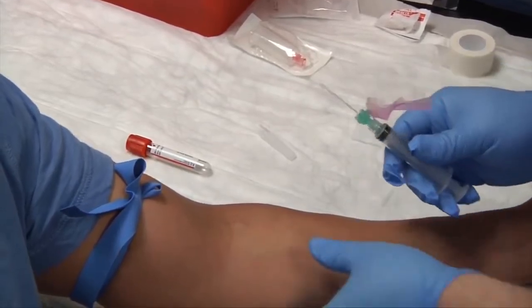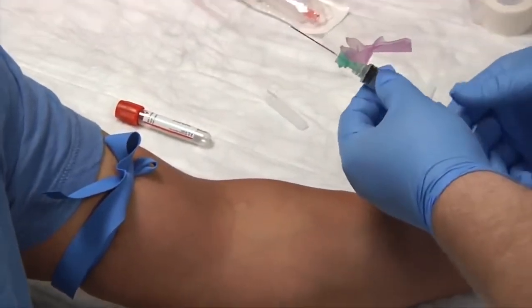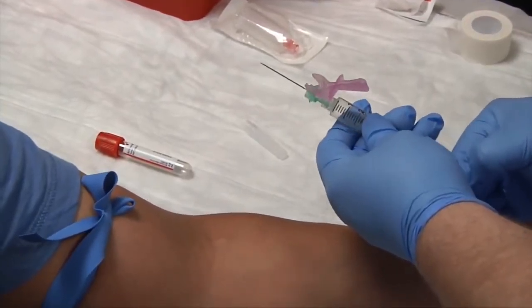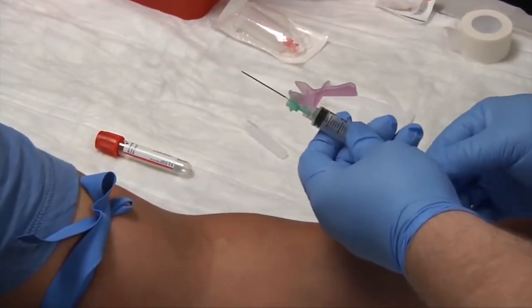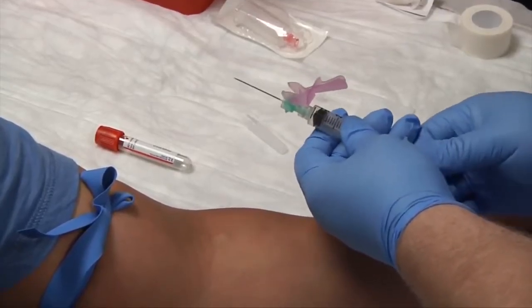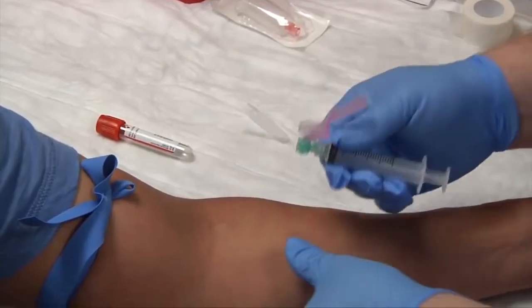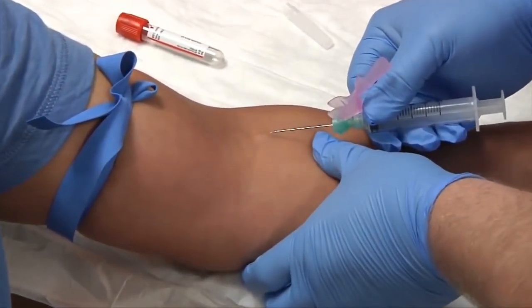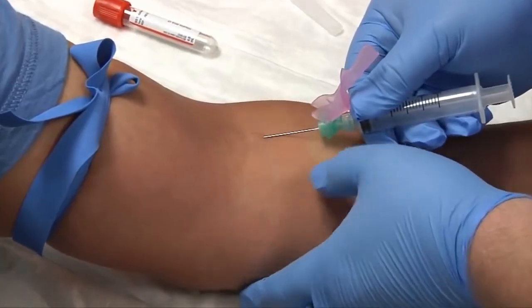It's good. And also with the syringe, before you stick your patient, you want to pull back on the plunger to loosen it. Sometimes the needles have been sitting for a couple of years, so you just want to loosen the plunger a little bit before you stick the patient. Anchor your vein, and one, two, stick.